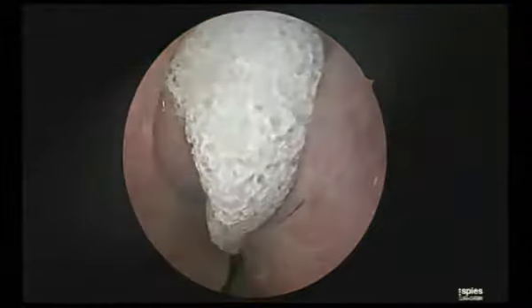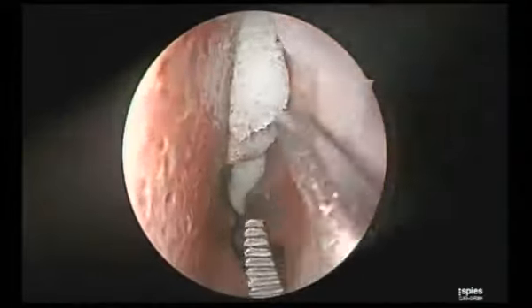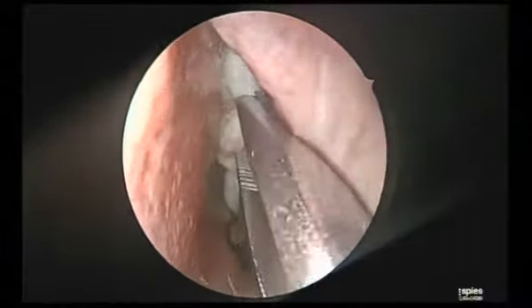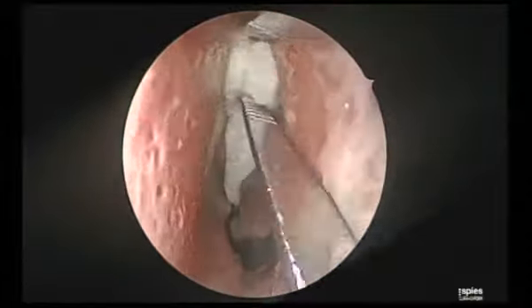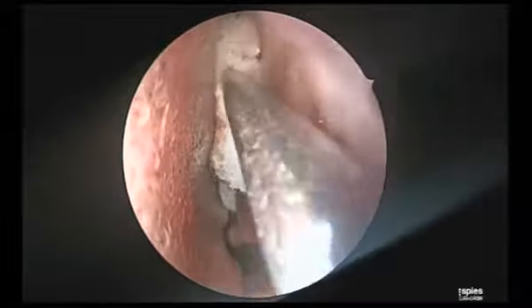So now coming to the preparation part, are you getting the endoscopic picture? Wonderful, absolutely brilliant, wonderfully prepared. Compliments to Arvind and Amol. The best part about Arvind and Amol is they never compromise with the quality. I've seen it set up earlier as well, with the equipment, instruments, every single small thing, they would never compromise.